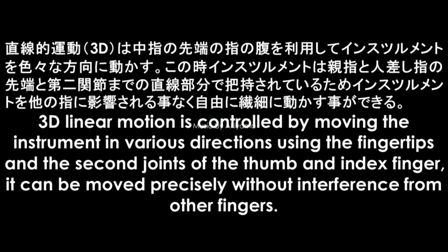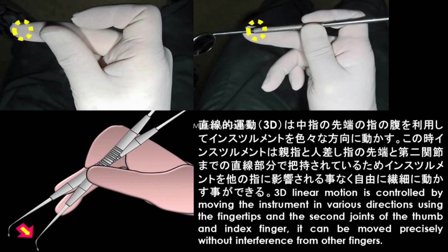3D linear motion is controlled by moving the instrument in various directions using the fingertips and the second joints of the thumb and index finger. It can be moved precisely without interference from other fingers.